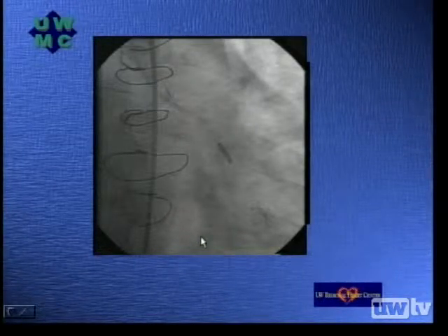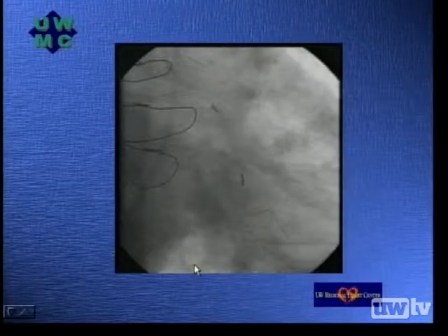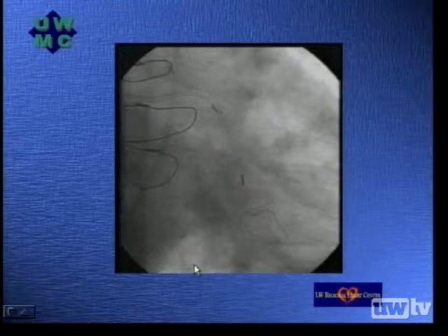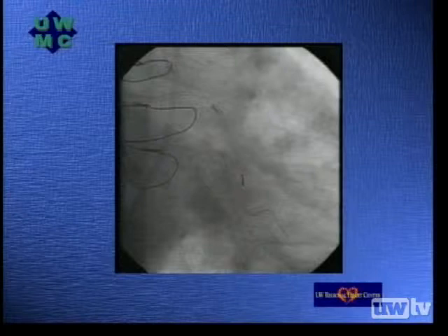It's impossible to see the microtome blades except very up close. Here is the radiation therapy catheter. This is a beta radiation source using strontium-90 and yttrium. It was placed in the vessel for a total of about 3 minutes, giving 18 gray to the vessel wall.